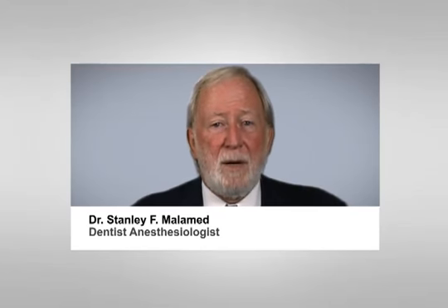You will find that using the STA system, the STA wand handpiece, and the birotational insertion technique will allow you to deliver a more comfortable mandibular block with a greater success rate and a shorter onset of anesthesia.